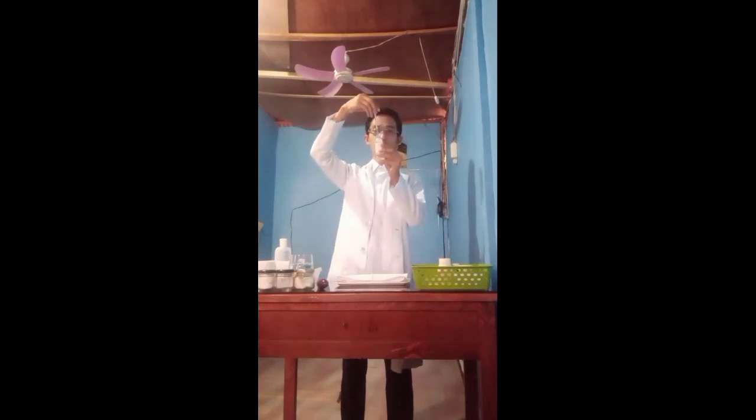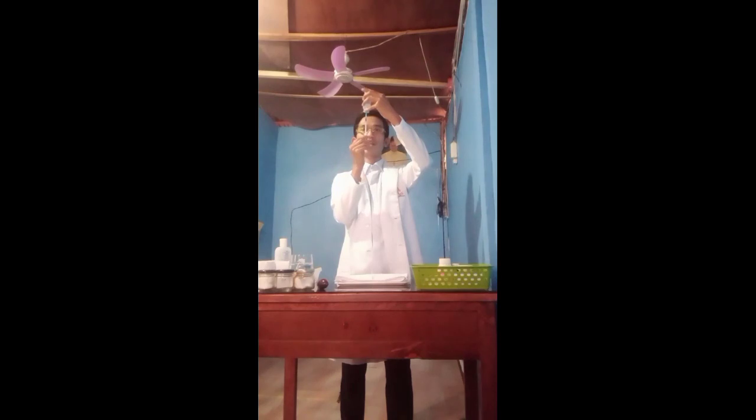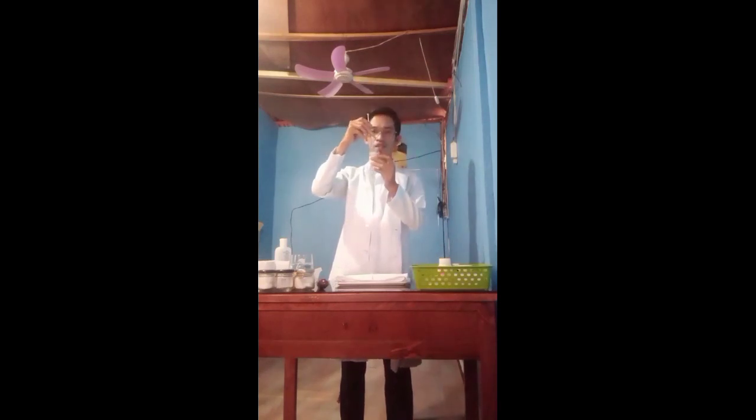Eye level. Five ml. So you have it ready.